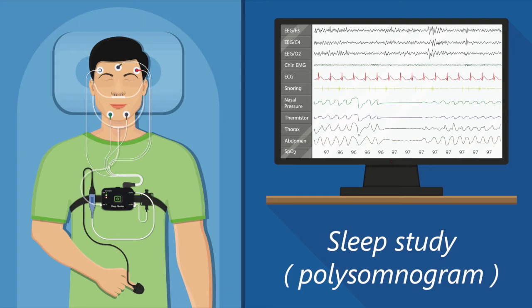That report is called a polysomnogram, and it measures the stages of sleep by brainwave analysis provided by the EEG that's attached to you. And it allows sleep disorder doctors to differentiate apneas that are not caused by airway obstruction, but by central nervous system irregularities, so-called central apneas. The standard for diagnosis requires a minimum of 4 hours of sleep data.